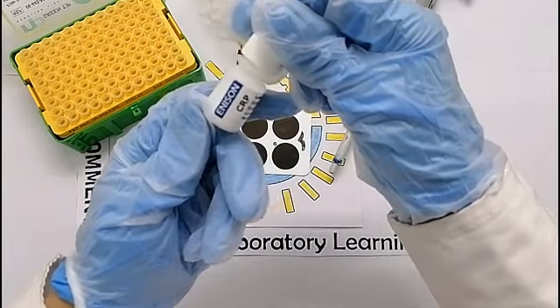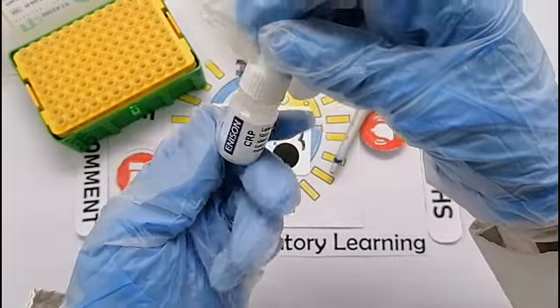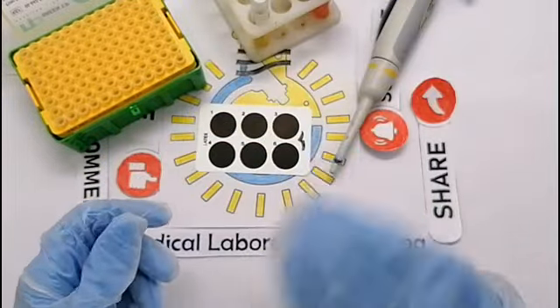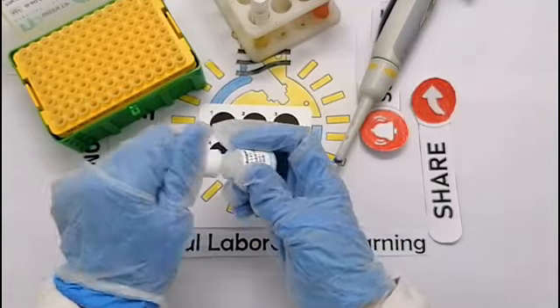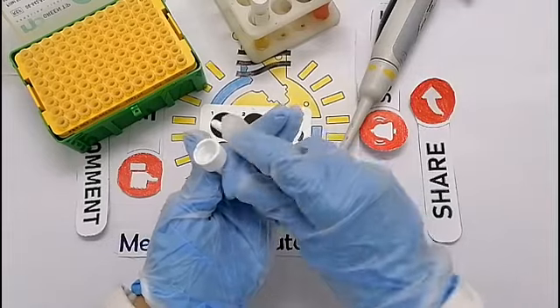After venous blood sampling from the patient and centrifuge it to separate the serum, we place 1 drop of the patient's serum and 1 drop of the CRP solution on the black circle of the slide.